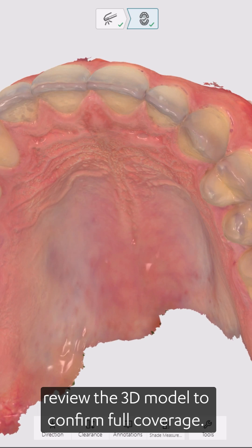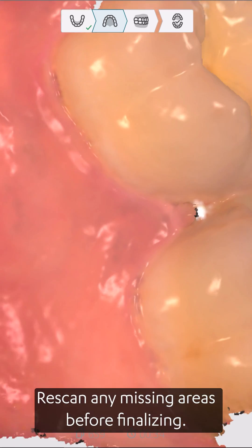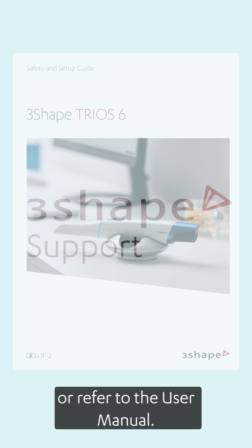After scanning, review the 3D model to confirm full coverage. Re-scan any missing areas before finalizing. For more details, visit 3Shape Community or refer to the user manual.